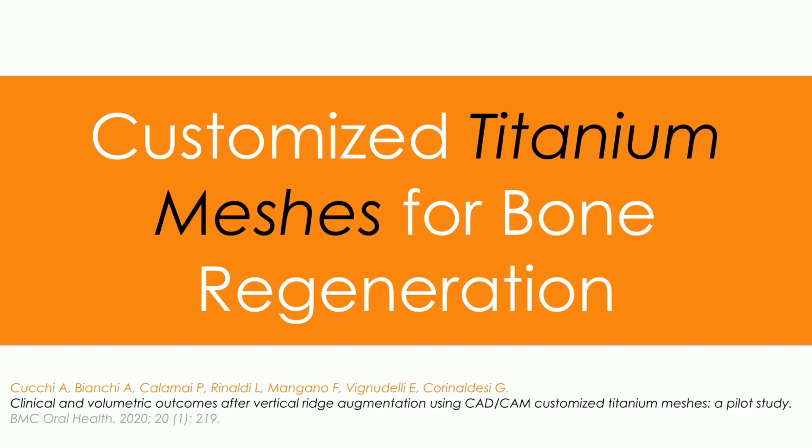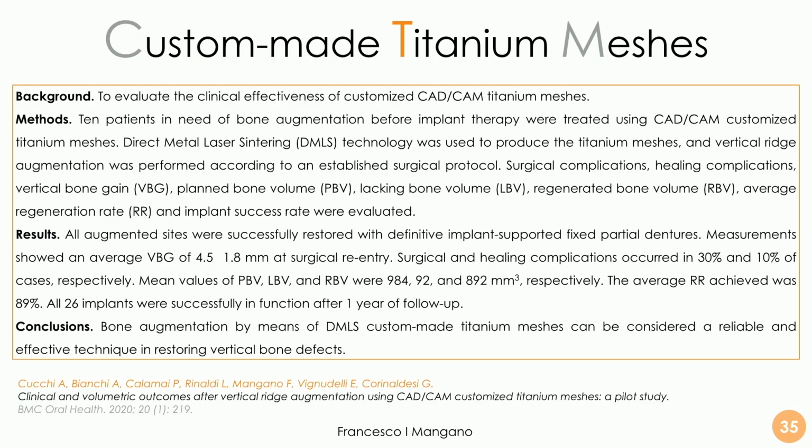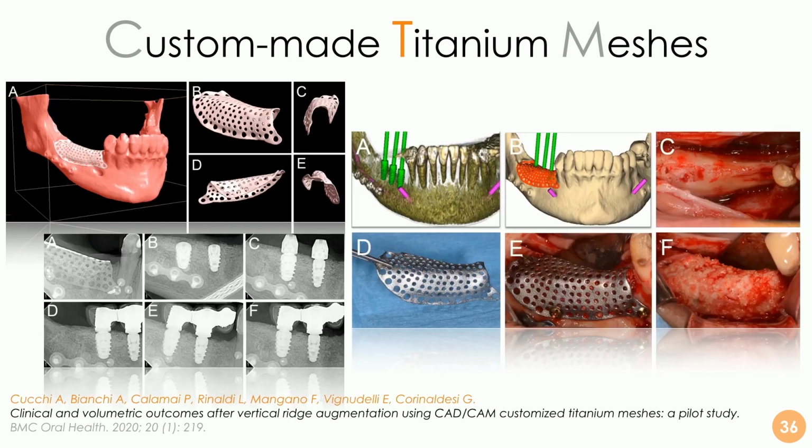So these meshes are membranes in titanium made custom on that defect for that patient in order to regenerate bone, and they work very well, as demonstrated by Cucchi and colleagues in this article, at least from the clinical point of view. As we can see, with a very good level of vertical augmentation, stable bone, new bone, very few complications during the surgery and during healing, and an excellent clinical result after all, with patients very satisfied.